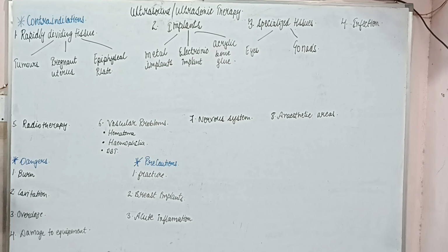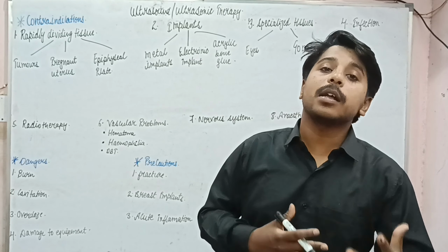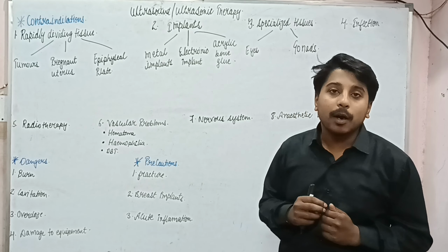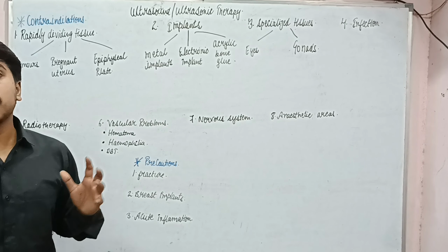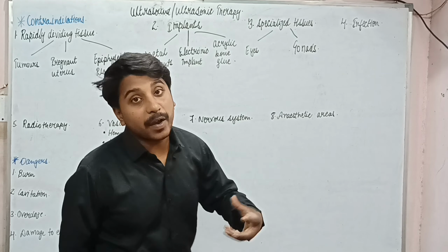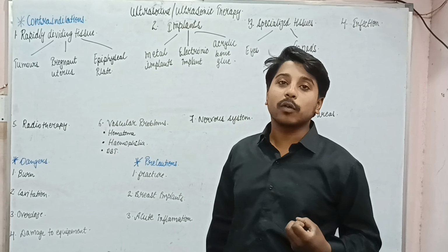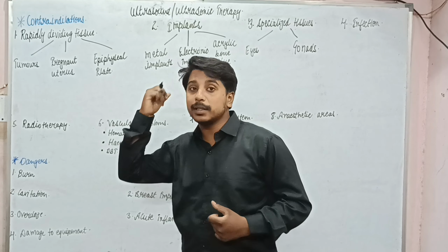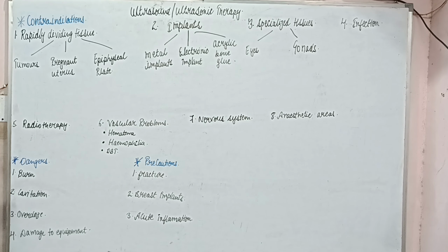If there is any kind of tumor, that means there is uncontrolled division. वहां पर क्या हो रहा है, डिवीजन, सेल डिवीजन जो है वो बहुत फास्ट रेट पर हो रहा है. And if we are applying ultrasound, which has an effect on the cell membrane, increasing the ions and the oxygen, that may further stimulate this tumor formation. So definitely we are not going to apply it.